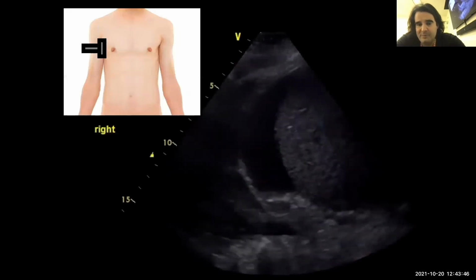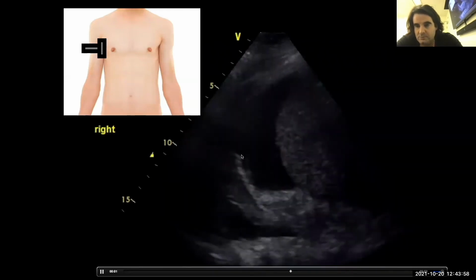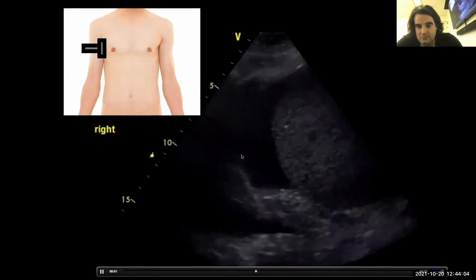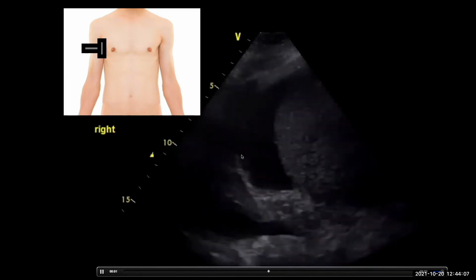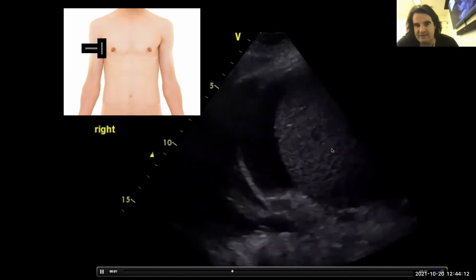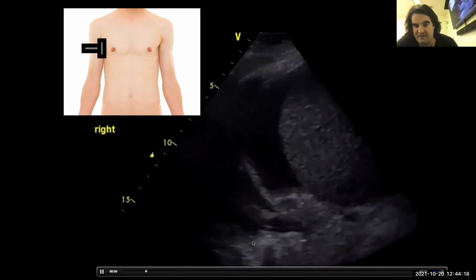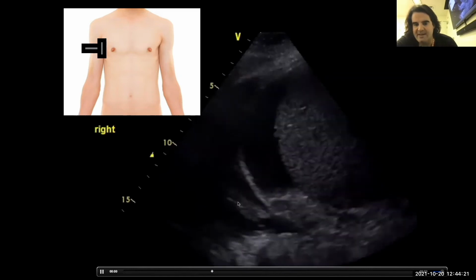So in examining this patient, it's quite high, around the fourth interspace, anterior axillary line, and I came across this. Can anybody describe to me what you think you're seeing here? Looks like diaphragm with subdiaphragmatic fluid fairly high up. That's right. And then there's the liver, subdiaphragmatic fluid. We see the spine here. So obviously we must have fluid above the diaphragm. So that's maybe lung there. It looks like it's probably mixed, pleural and also subdiaphragmatic. So it's probably both.